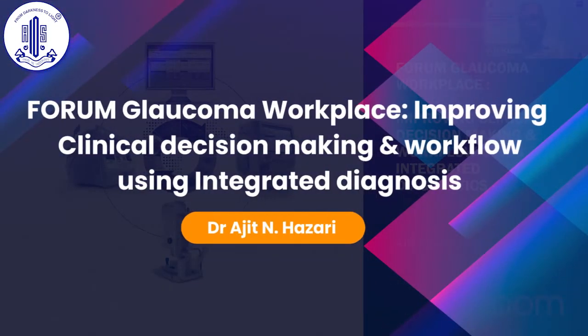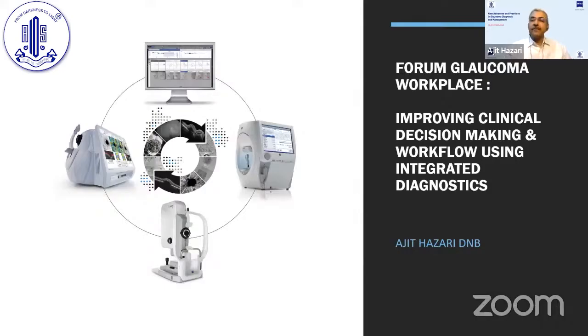Yes, thank you for inviting me for today's talk. I'll be speaking on integrated diagnostics and how it helps in decision making and workflow using the Forum Glaucoma Workplace.